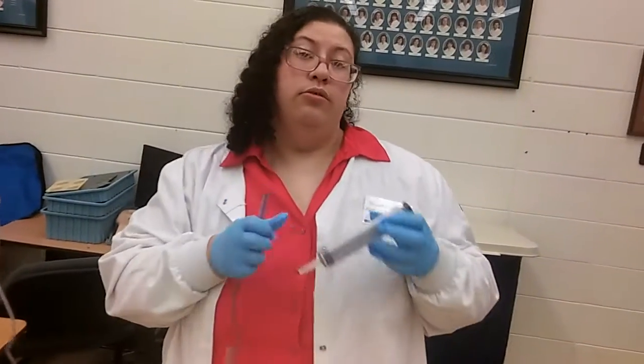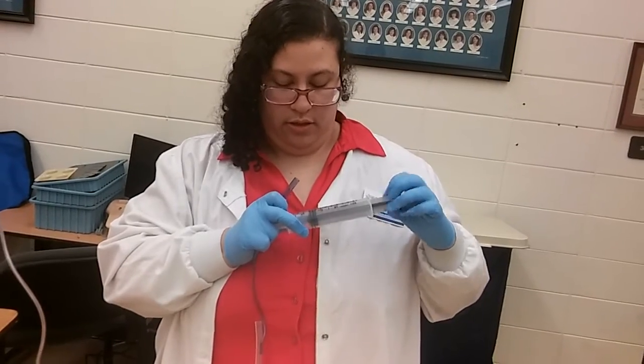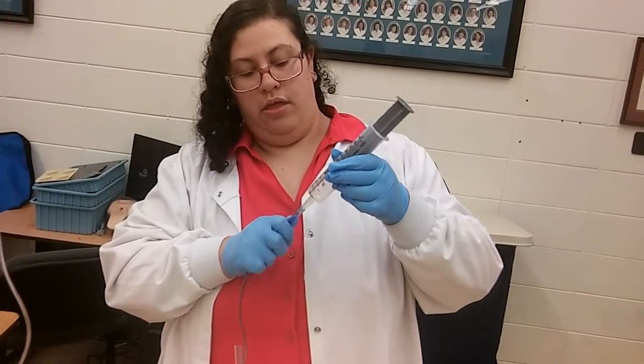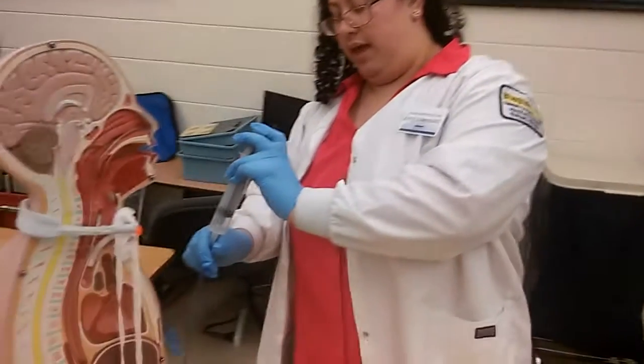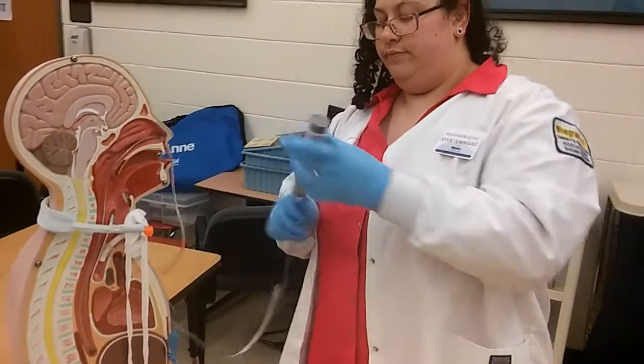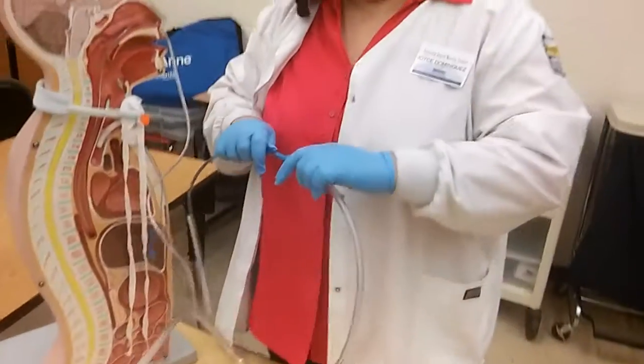Then we're going to inject air into the blue tube, placing it above the stomach, and then we're going to reconnect to suction.